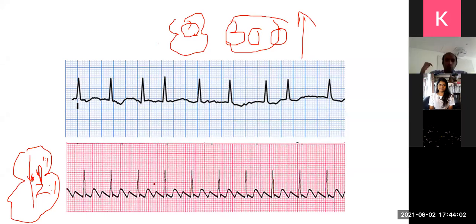Okay, fine. So these are the examples of atrial rhythm. Atrial fibrillation is when you have an irregular baseline with irregular QRS complexes, right? Abnormal P, normal QRS. Sawtooth P is again an abnormal P wave and a normal QRS. Right. Sasank, I will explain how to calculate heart rate in AF when we do a few more practical examples. I'm just teaching the basic rhythm analysis here.